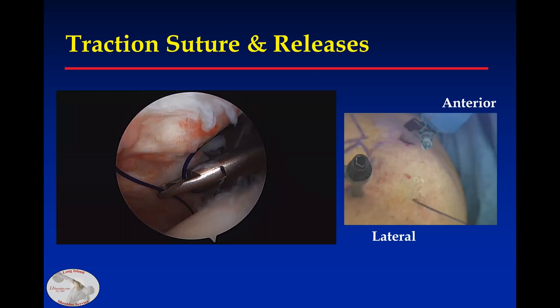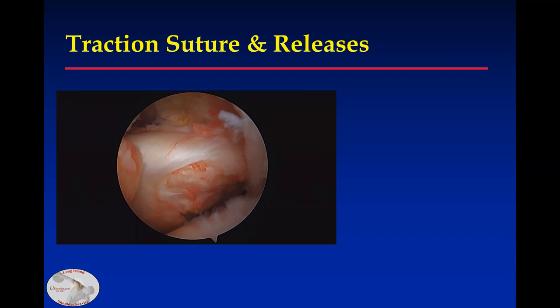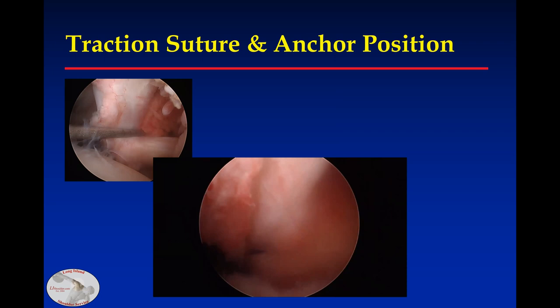Traction sutures are very helpful. You can see one brought through an anterolateral puncture, and when you bring it laterally, it exposes the area so you can do releases around the subscapularis. I also use traction sutures to help with anchor position. Once I've done the releases with the arm in neutral position, if I can bring my subscapularis to that position, that's where I'll place my anchor and get a nice secure repair.